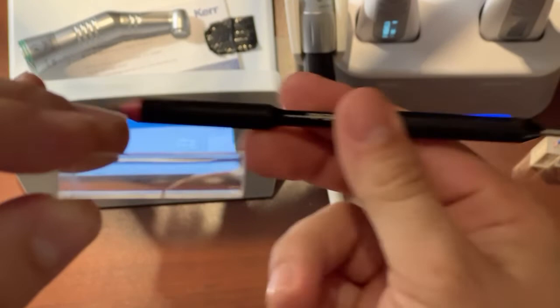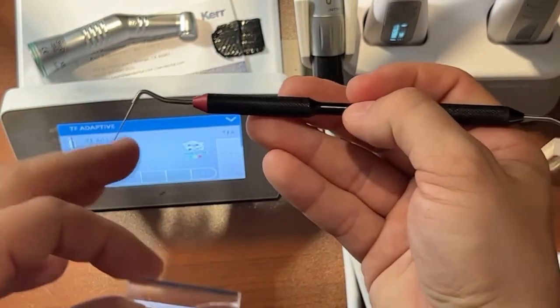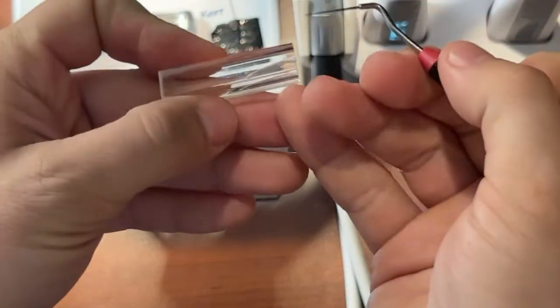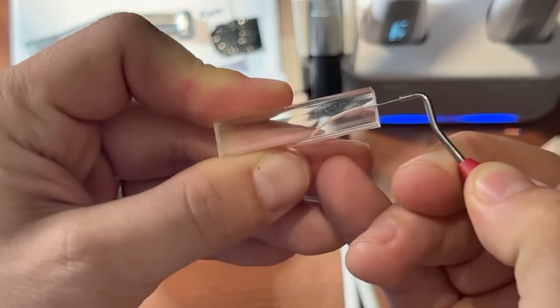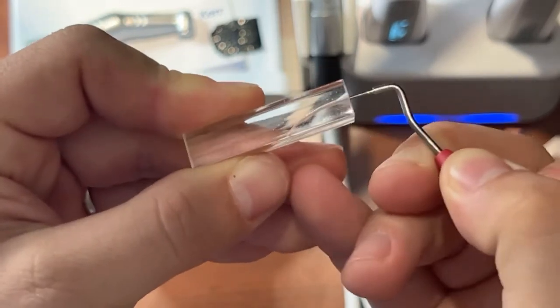And then what we're going to do is take our Buchanan hand plugger. It's got a NiTi side that's a little more flexible, and then a stainless steel side that's not as flexible. So we're going to now condense this plug that we created down at the apex.